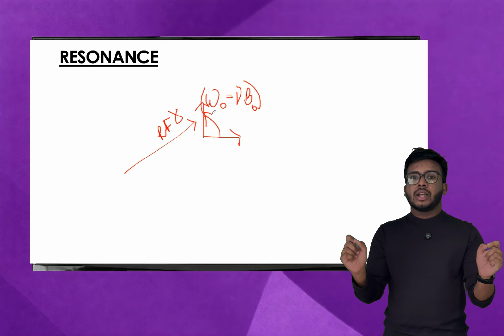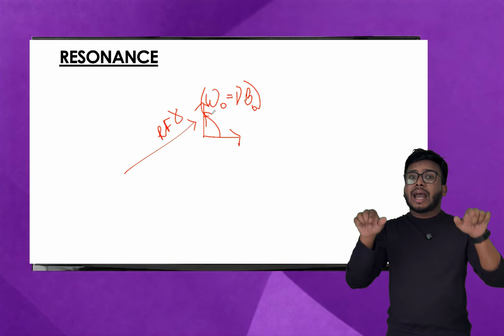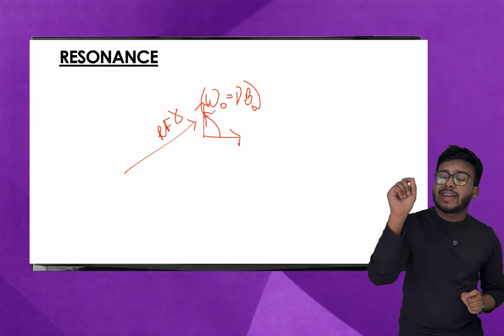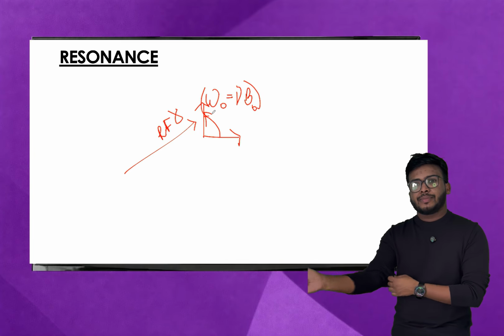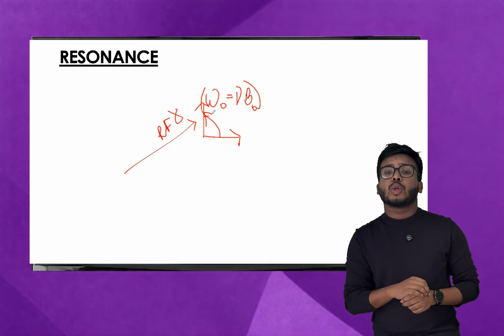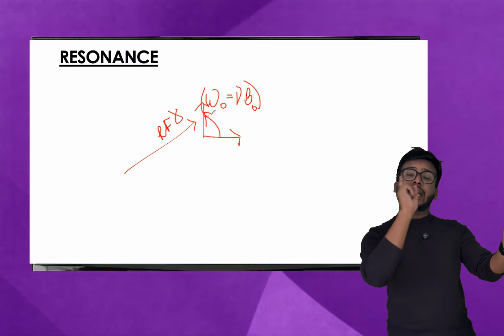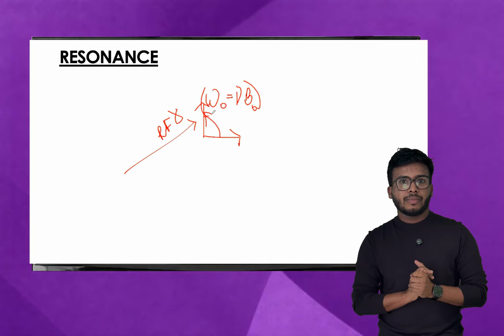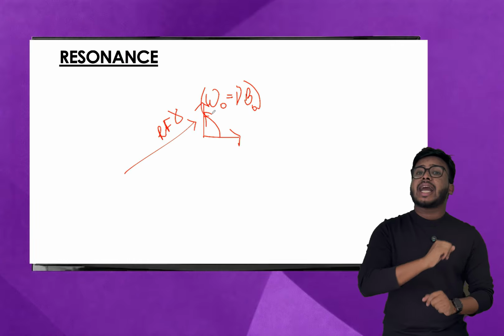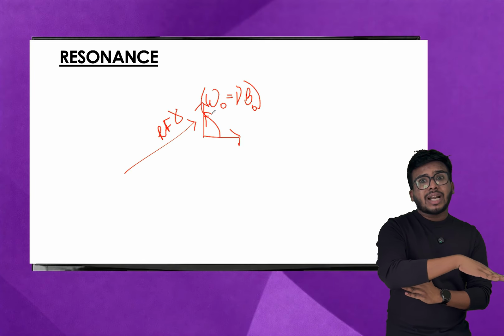I repeat, when we keep the patient inside the MRI machine, the protons will align parallel and anti-parallel. Most of the protons are in the parallel direction, so the net magnetic vector is in longitudinal magnetization. The influence of the external magnetic field creates an extra spin on the proton, that is precessional frequency. To create resonance, we send a radio frequency pulse. By sending a radio frequency pulse, it resonates and excites the transverse magnetization. By getting the RF pulse, it excites, and by switching off the RF pulse, it relaxes.